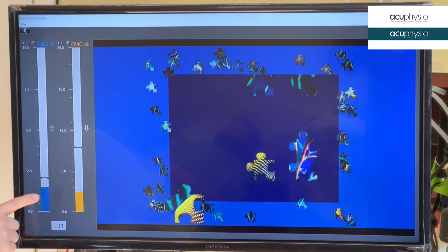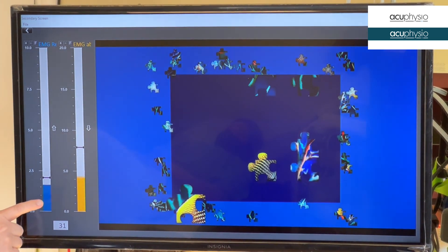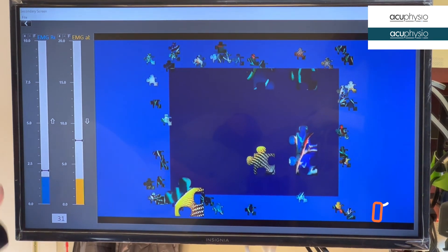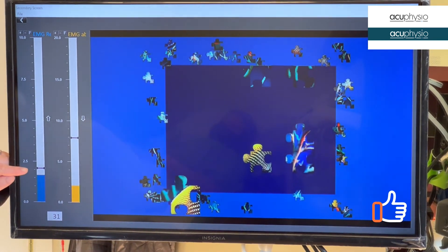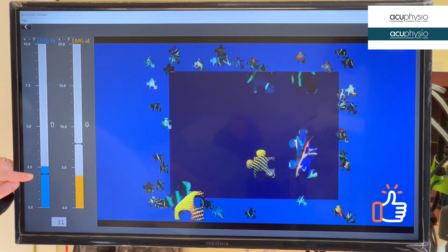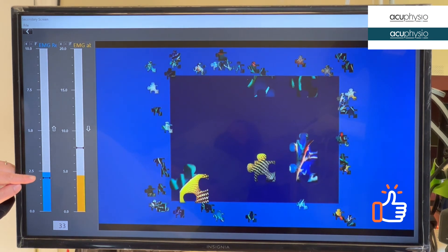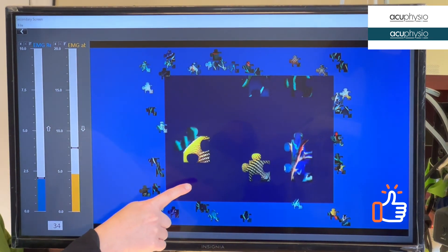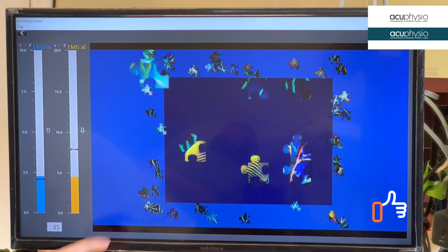If you feel comfortable looking at this graph, I'll give you the graph. Contract. Good. You see the puzzle is moving? Just like that.